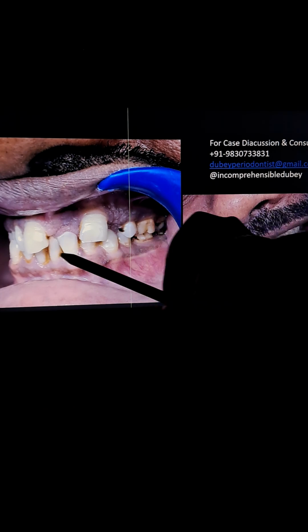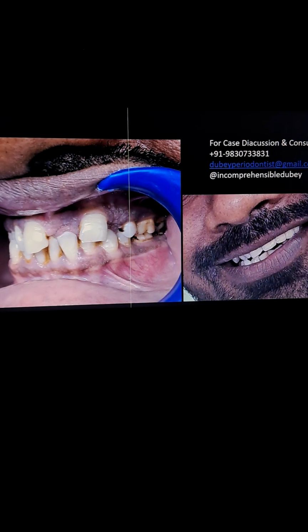As you can see, this was the pre-op condition of the patient, and here are the beautiful alignment and harmony in the post-op condition. There was not much surgical complexity involved in this case. The trick was the planning of the jaw relation and the management of the occlusion. We also had to do some incisal grinding of the lower teeth to get the necessary results, slightly on the incisal surface and to some extent on the labial surface.